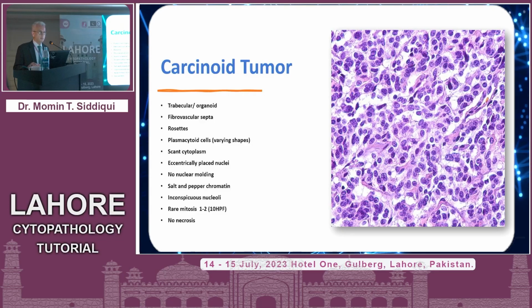But other features that should be looked for are presence or absence of necrosis. Common knowledge, all the books mention it. These tumors should lack necrosis. And that's something you should look for in your smears as well.